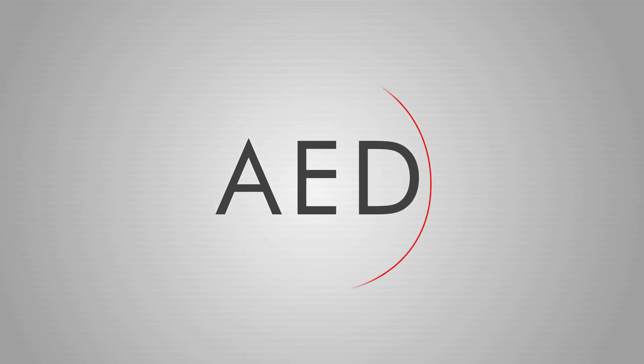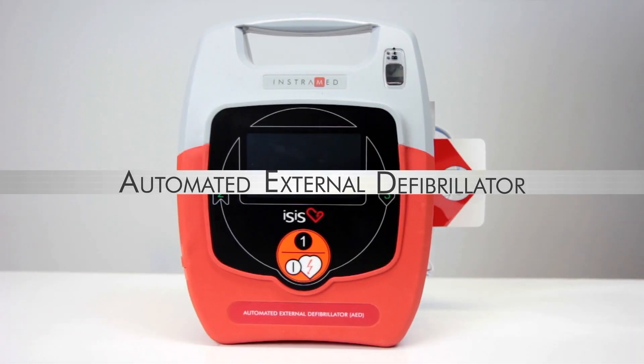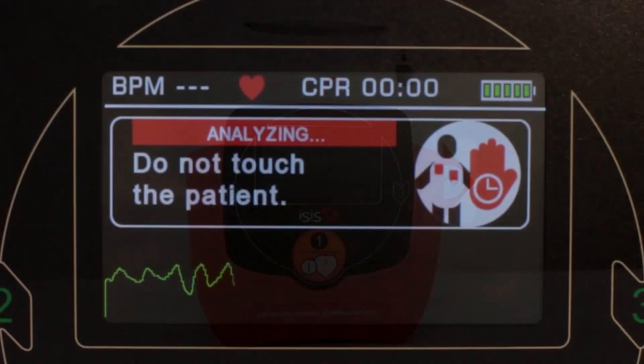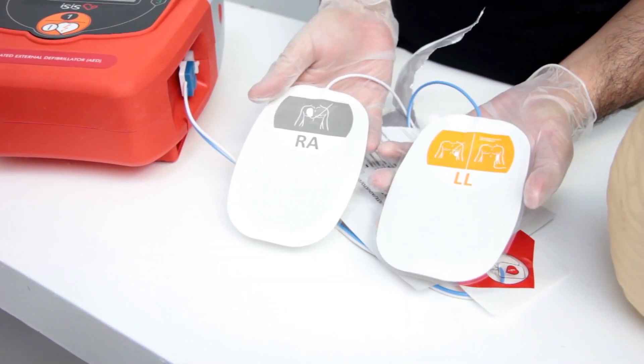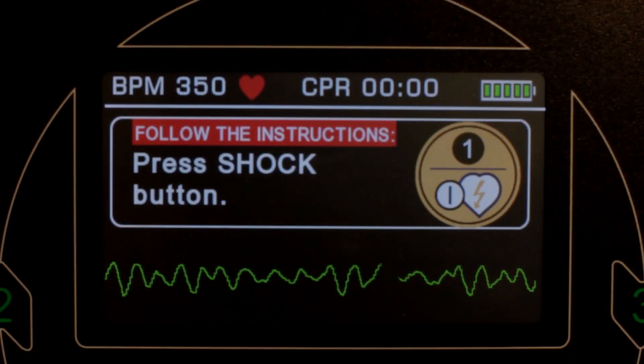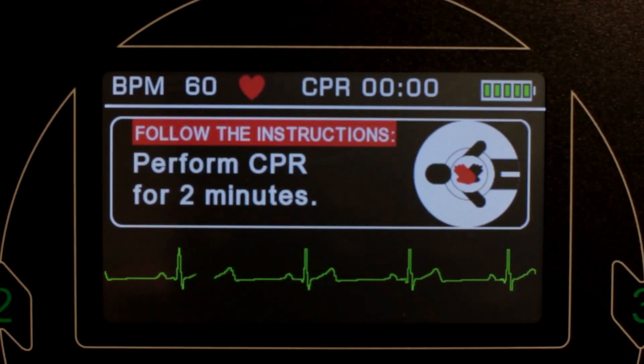The ESIS is an AED, or Automated External Defibrillator. This device uses an EKG to assess the condition of patients experiencing cardiac arrest, consider the clinical variables, and automatically apply the appropriate shock.